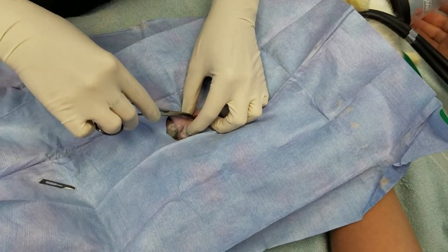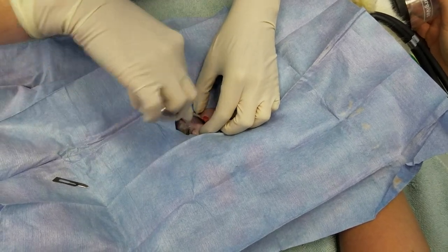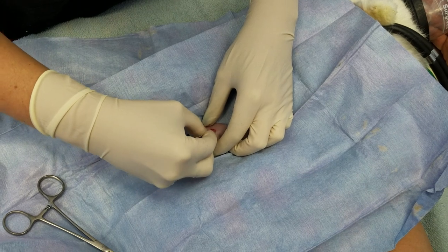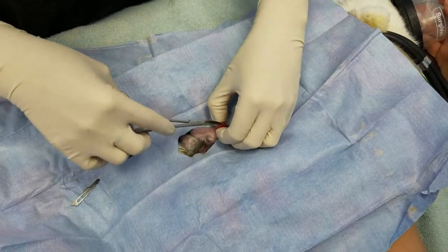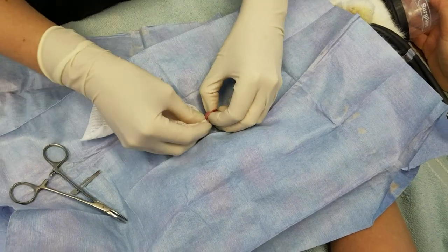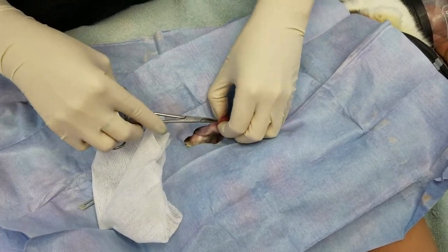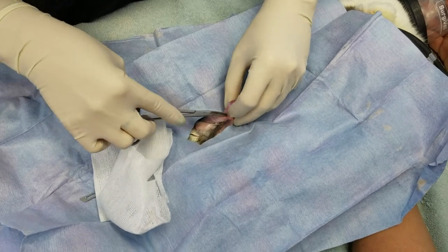He's a little light, Hannah. We're gonna turn him up on his ISO. Tend to be pretty firmly adhered. So kind of gonna just bluntly dissect them out.